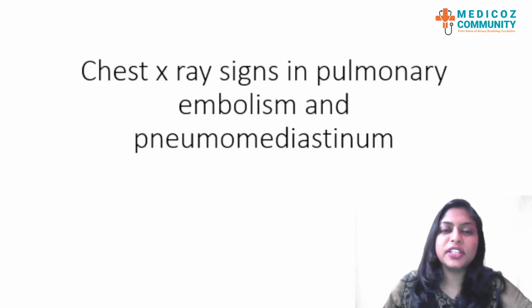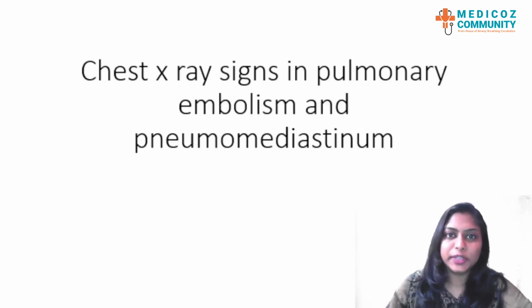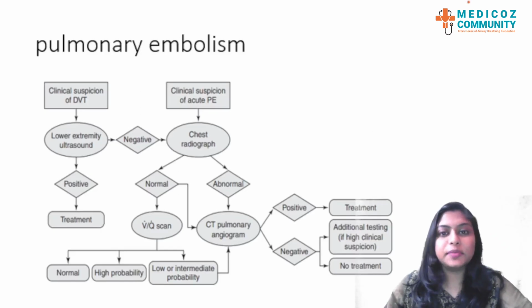Our topic for discussion today in radiology is chest X-ray signs in pulmonary embolism and pneumomediastinum. First, let us go through the topic pulmonary embolism. So, what is pulmonary embolism? As we all know, the pulmonary artery is obstructed with an embolus or a thrombus.